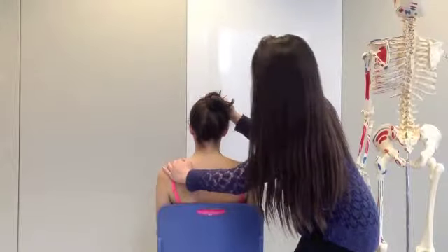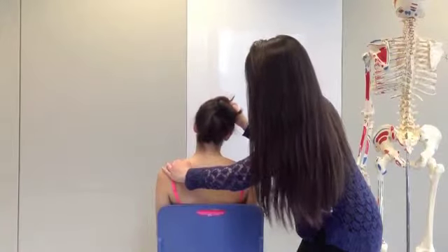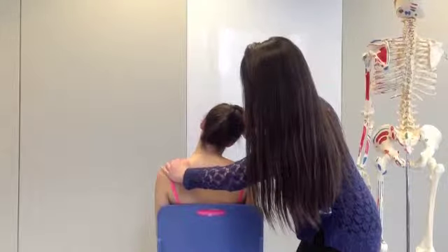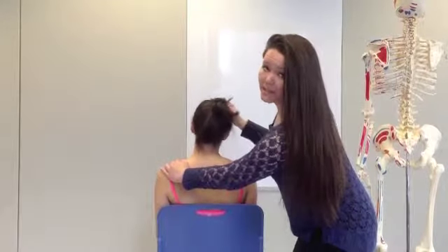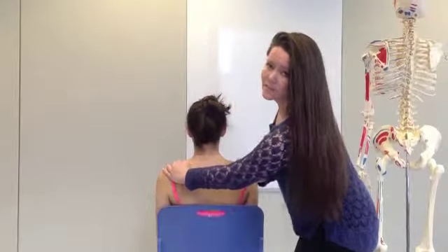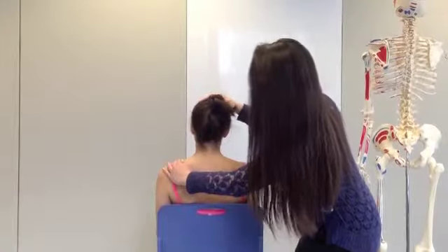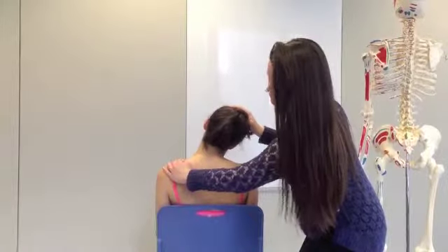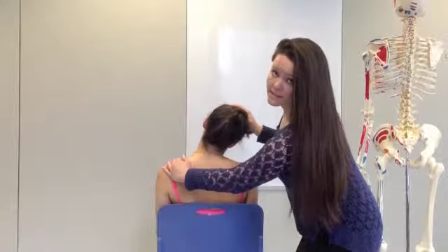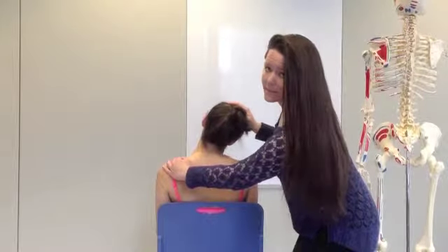Then we're going to gently lay our hand on the contralateral side of her head and then guide her head in the motion that we want to observe. And then we can also ask if there's any pain with that motion, just so we can stop and make sure that we don't aggravate any conditions any worse. While we're doing the side bending motion, you want to make sure that she stays in that frontal plane and that there's no rise in the shoulder that we're stabilizing, because that would signify side bending in the thoracic spine as well.